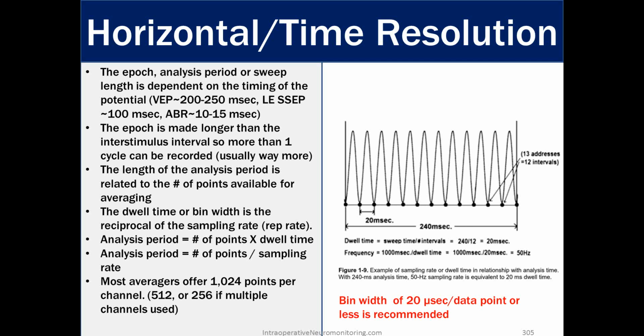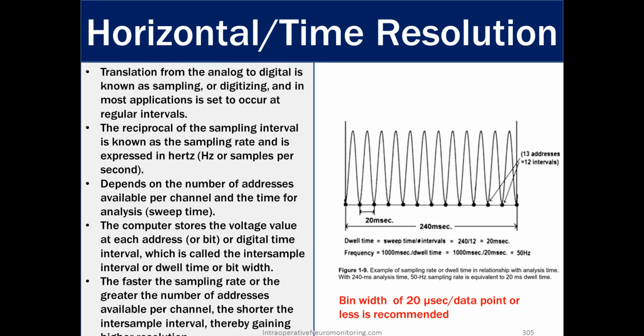So you do have to know this equation for analysis period in both forms and be able to figure out the analysis period. Bin width of 20 microseconds per data point or less is recommended. Again, that's just a number that you have to have memorized.